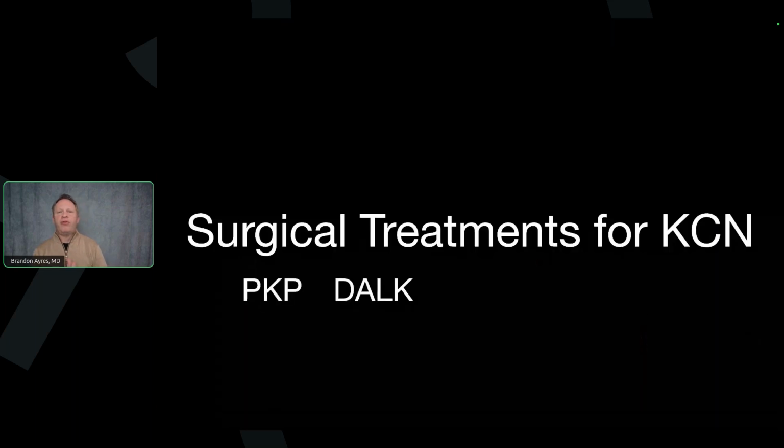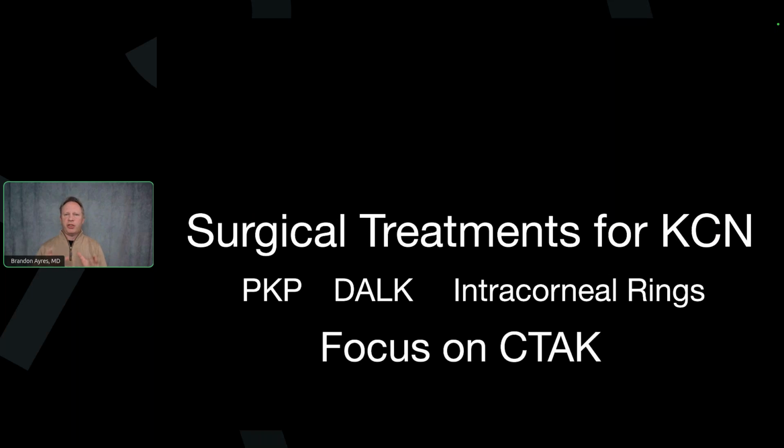All right, so I'm going to move forward here because that just shows how much time we spend looking at the Pentacam. And I now realize I was saying things twice, but I guess repetition is the key to learning. So with the Pentacam being the center of our diagnostic device and really guiding our treatment algorithms, does this patient need cross-linking? Does this patient need CTAK? Does this patient need both?